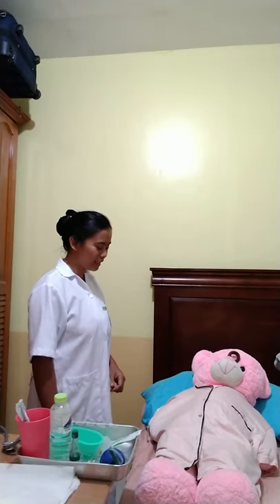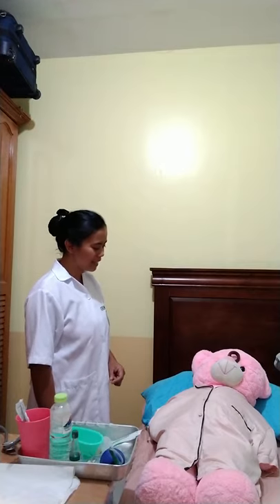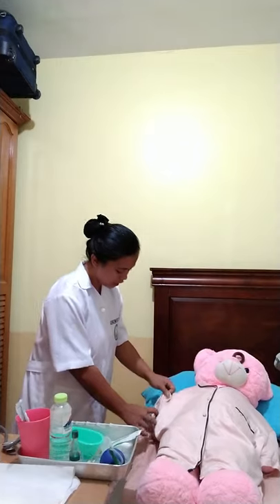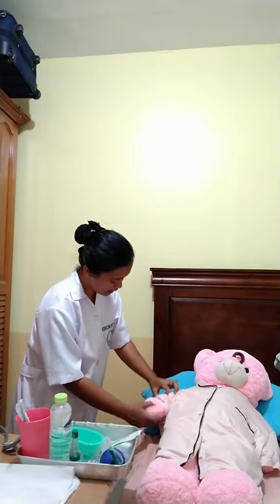Implementation. The first thing under implementation is to identify our patient. Introduce yourself and get the complete name and birth date of our patient, then verify it using the wristband. Good morning, Sir Ted. I am Jelly Franklin. I'll be your nurse today. May I know your complete name and birth date? Okay. Can I check your wristband? Thank you.